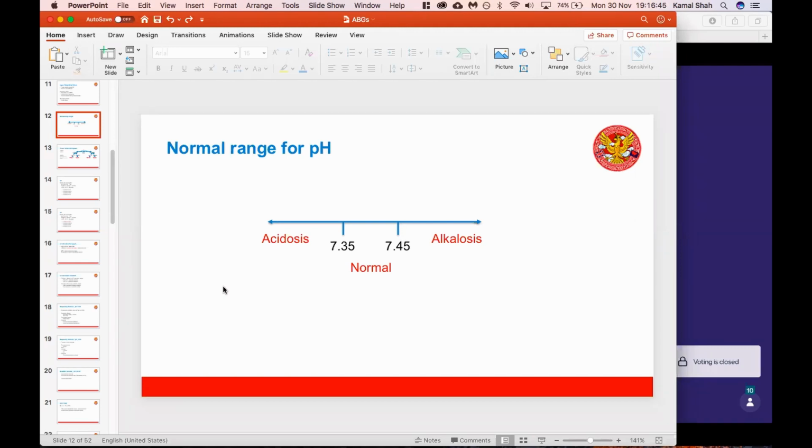How do you know it was always normal? So is the question, how do we know that it wasn't always normal? Essentially, if everything is normal, then there's no abnormality. Whereas remember, what I said was, if the pH is normal and there are abnormalities elsewhere, so abnormalities in carbon dioxide and bicarbonate, we know that this isn't normal.